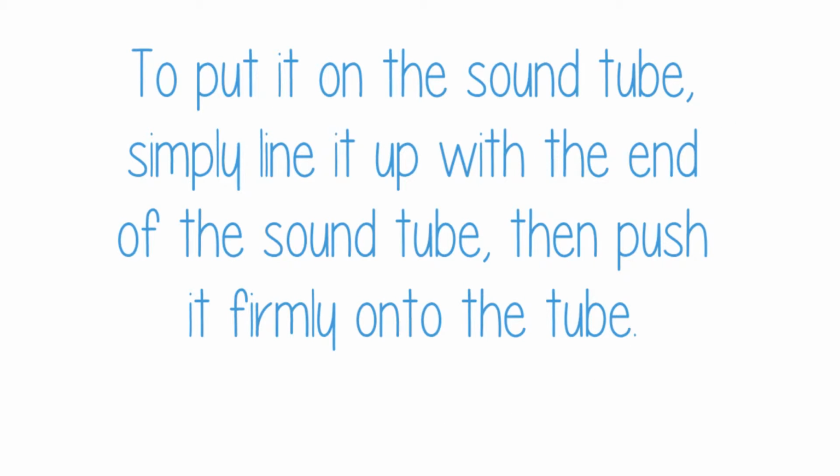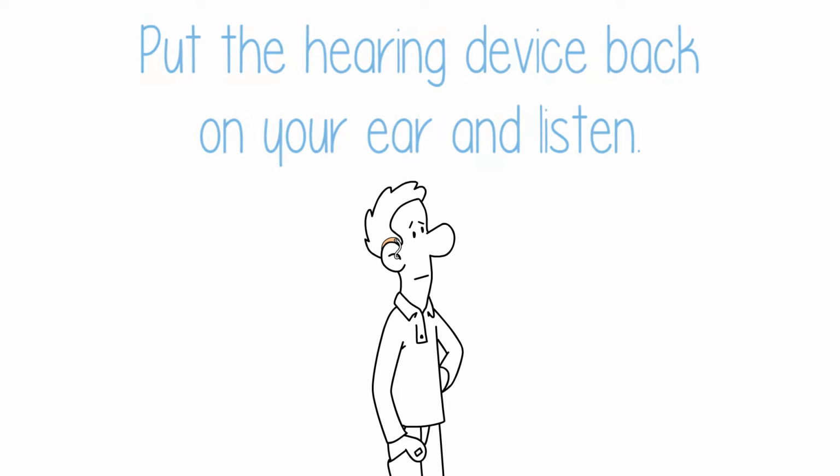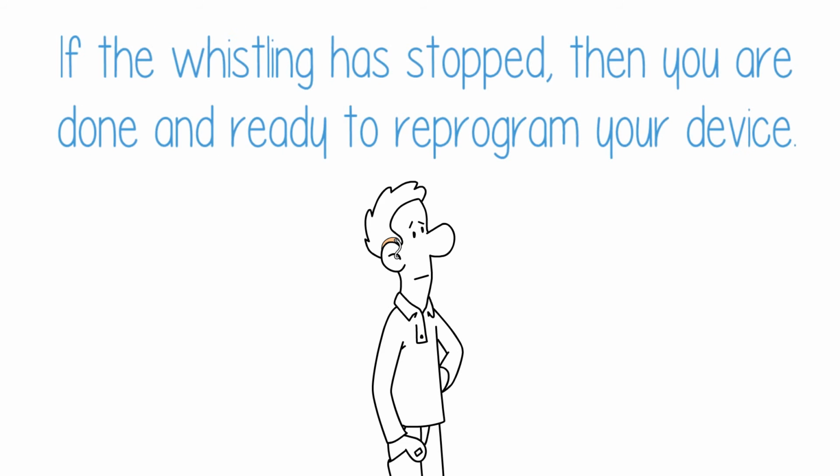To put it on the sound tube, simply line it up with the end of the sound tube, then push it firmly onto the tube. Put the hearing device back on your ear and listen. If the whistling has stopped, then you are done and ready to reprogram your device.